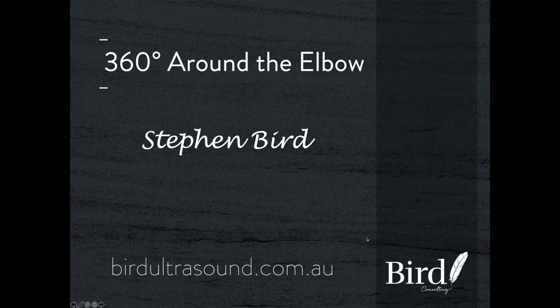The elbow is one of my favourite joints for assessment with ultrasound, and the reason it's so good is because we have this wonderful 360-degree access to the joint. Nothing's too deep, we don't have adiposity as a problem, everything is just perfect for ultrasound, and nearly all of the significant pathologies that can create elbow pain we can see nicely. The first thing I like to do when I assess any articulation is to ask the articulation itself if it has an effusion, to determine if there's any intra-articular cause of the patient's pain.